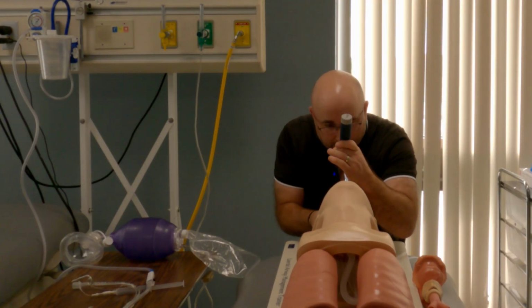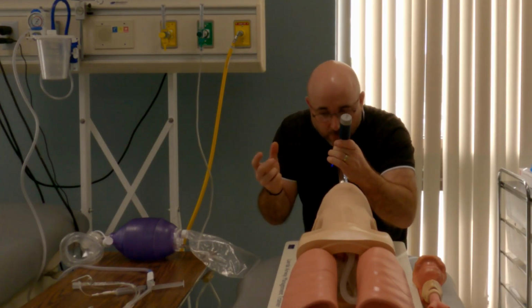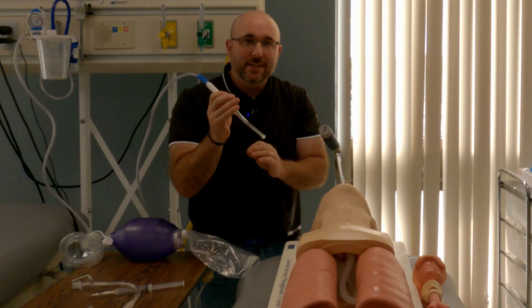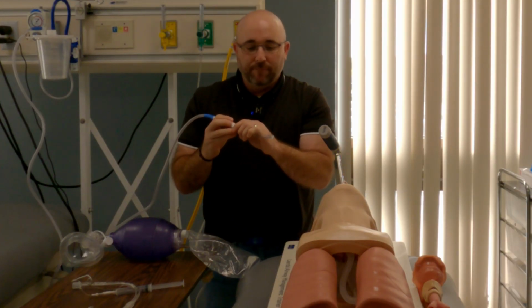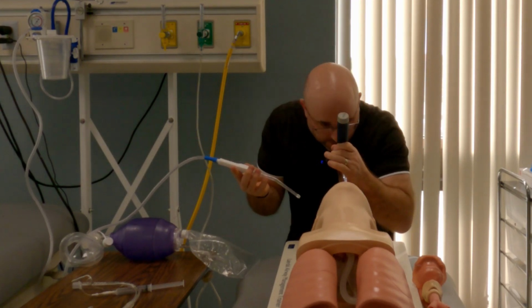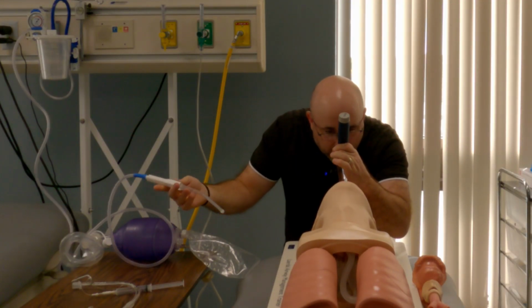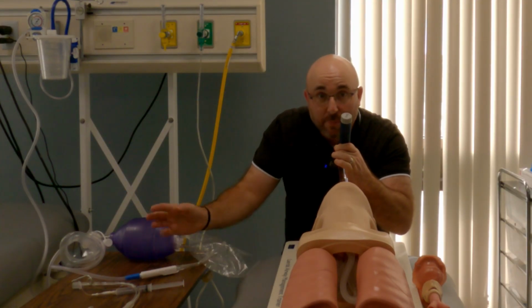A lot of times when I'm looking and intubating, I may say to the assistant, I need some suction, and that's why I'll reach right here with my right hand, looking for the suction to be handed to me somewhat like this. If you handle it like this, it's not a big deal, whatever way, but the best way is to have it turned on, full suction, so that it gets handed to me like this, and I can go in and clean out some areas real quick. And usually when they're finished using this, they're going to ask, can you hand me the tube?